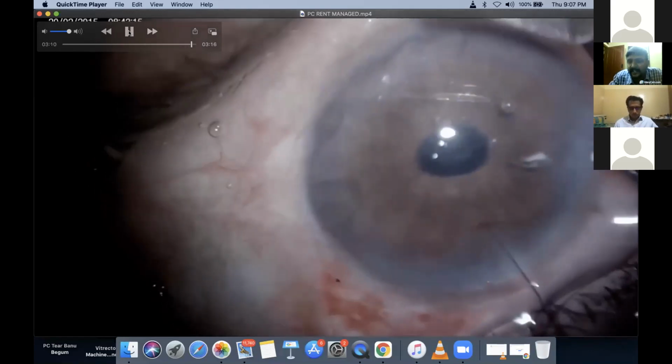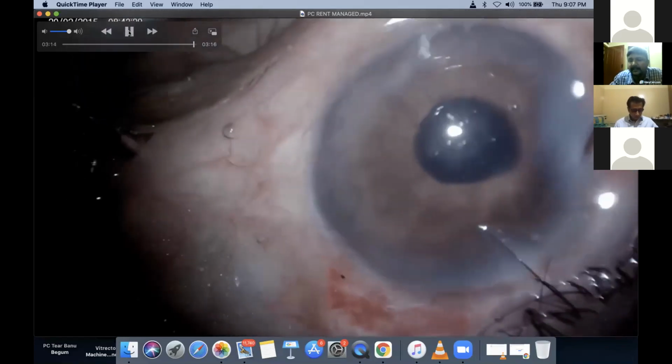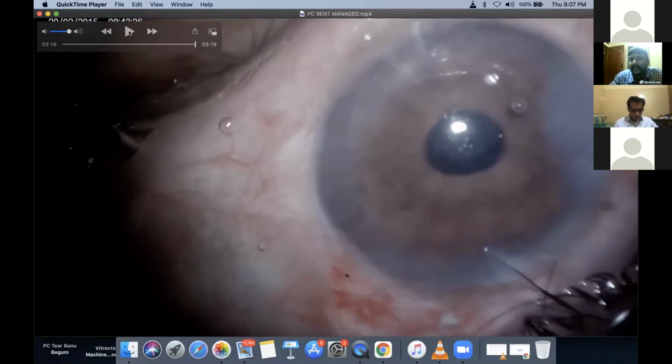The patient is now 1 month post-op, 6/24 uncorrected vision as of now, no corneal edema, no corneal decompensation, and a cylindrical power of plus 1.5 was noted. Thank you, sir.